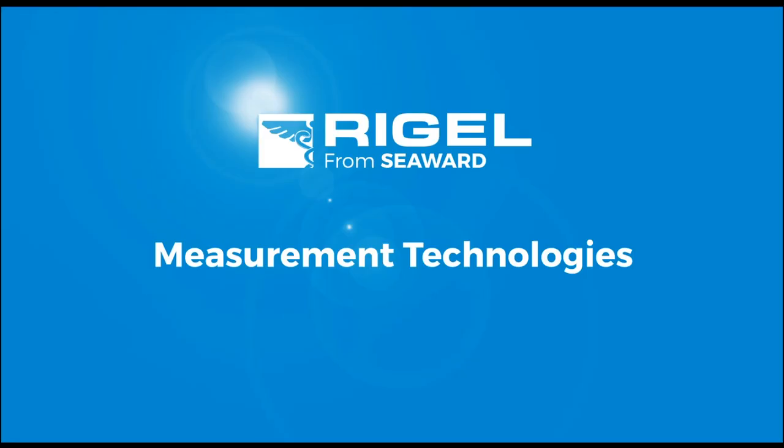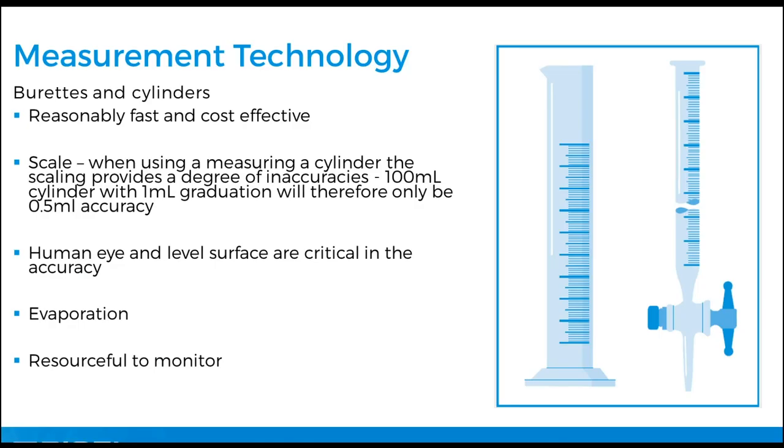So measurement technologies. We've got burettes and cylinders, which are pretty much the basic in any type of laboratory to measure volume. They're reasonably fast, cost effective, but the scale is a factor because the scaling has limitations because of the degree of accuracy between the scale itself. You've got to rely on the accuracy of the human eye and how level it is. It needs to be on a level surface to get premium accuracy.